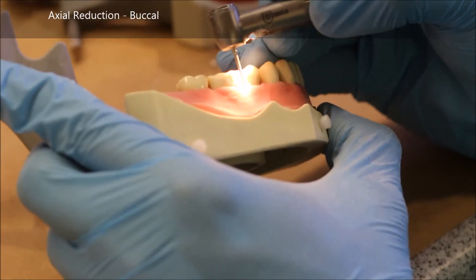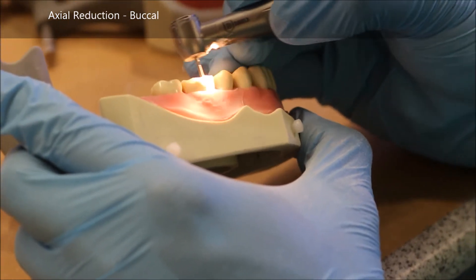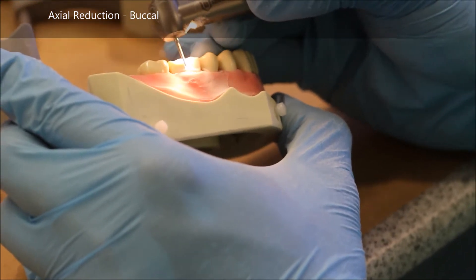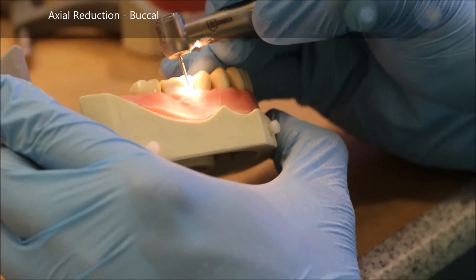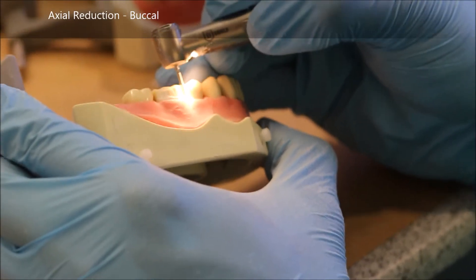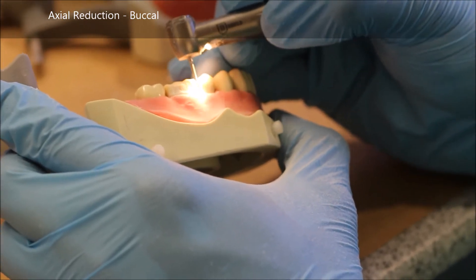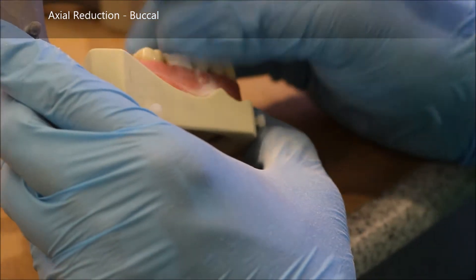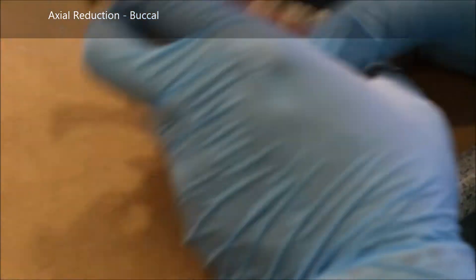You start generally in the middle, and you can place depth cuts if you'd like. Since this is a full gold crown, the finish line we're going to use is a chamfer, and the 878 is a chamfer diamond. By placing this tapered diamond burr roughly vertical — or somewhat leaned in as dictated by adjacent teeth — you can take down the buccal surface 0.3 to 0.7 millimeters where the finish line is, and a lot more where the cusps flare outwards.